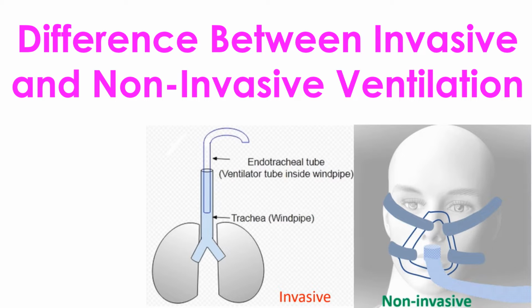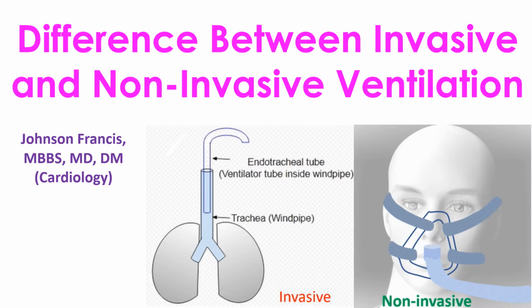Ventilator is a device used to support breathing. It is used when there is difficulty in breathing or when spontaneous breathing has stopped. Ventilator is an important life-supporting device useful in many life-threatening conditions.